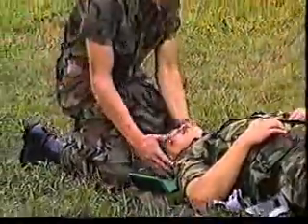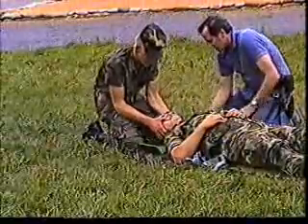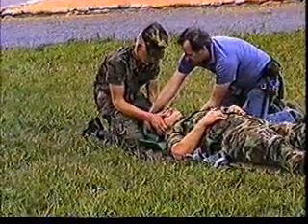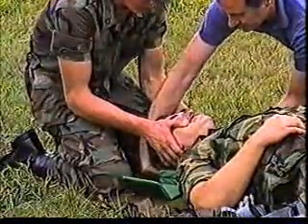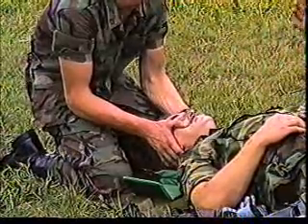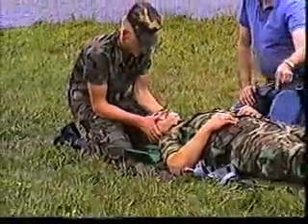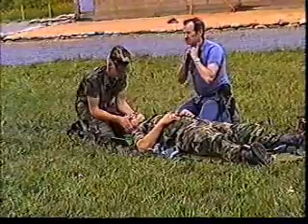So go ahead. I've already determined that he needed, okay, not a lot of tension, just hold it where there's no weight on the head. Now I can very gently slip this behind him. Continue to hold. Okay, now I want you to hold that until I get his body totally secured. We're not going to immobilize the head first, because when we start fastening all these straps, we're going to move his body around, and we're also going to move his C-spine.